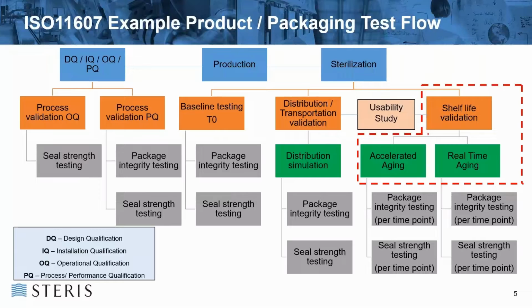Then you have your distribution validation of your packaging and how it works through the distribution cycles. Again, you have package integrity and seal strength testing that needs to be carried out at that stage. Finally, what we look at next is the shelf life validation, or your accelerated aging and real-time aging, and what has to be done there.